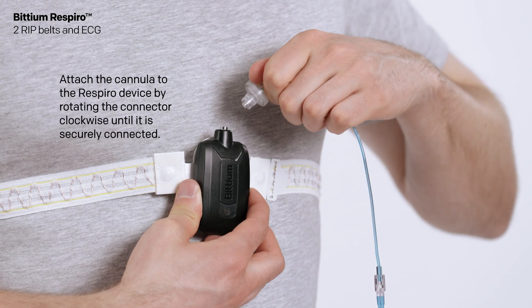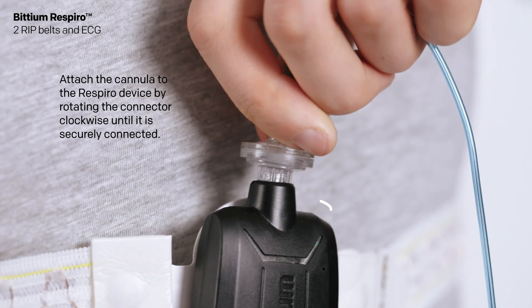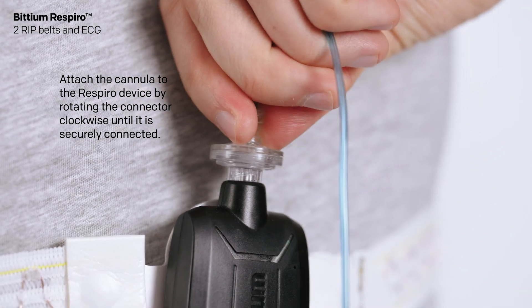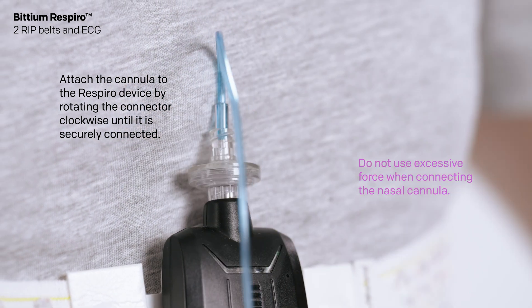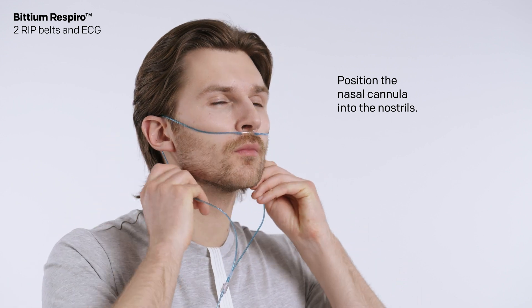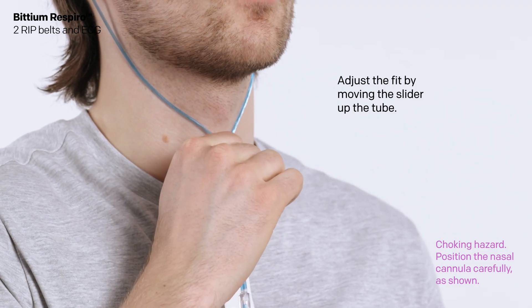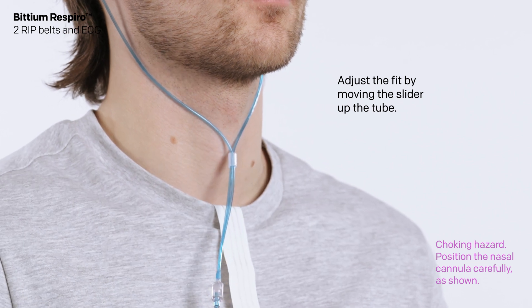Attach the cannula to the Respiro device by rotating the connector clockwise until it is securely connected. Do not use excessive force when connecting the nasal cannula. Position the nasal cannula into the nostrils. Adjust the fit by moving the slider up to the tube. Use medical tape to secure the cannula.